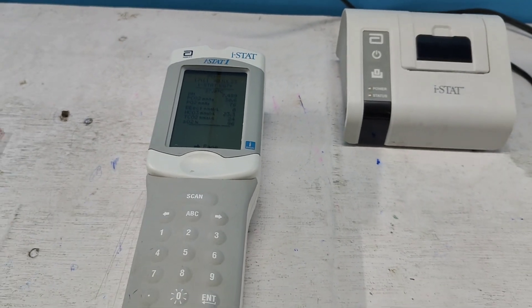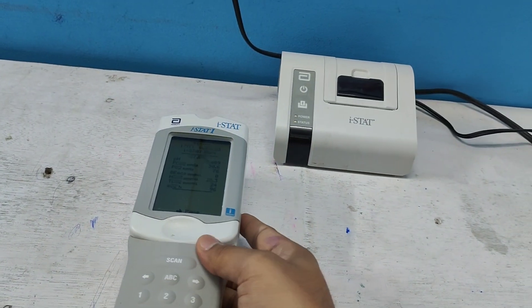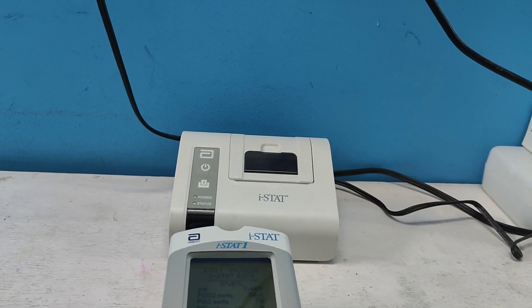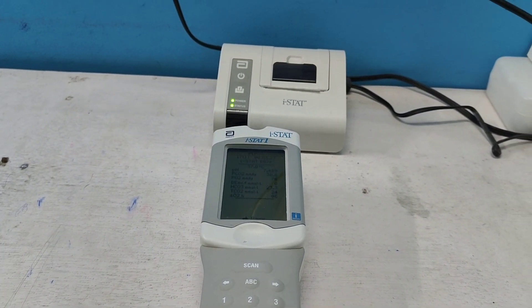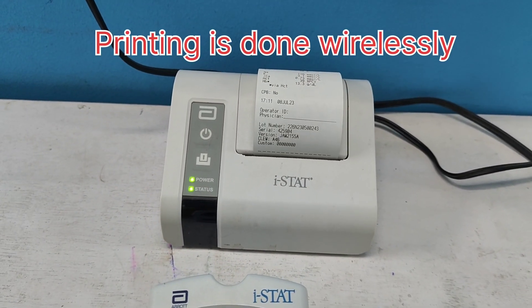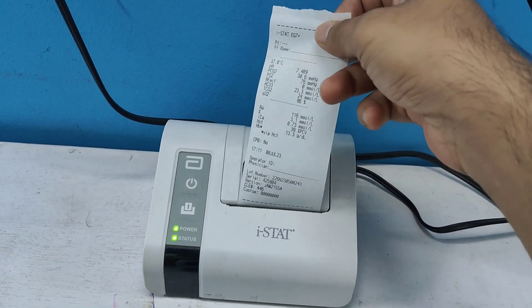Now I have to print the result. I place the printer nearby and position this machine in front of the printer sensor. Here is the sensor. Let's press the print button — this one is the print button. The printing is done wirelessly, and here is the result.